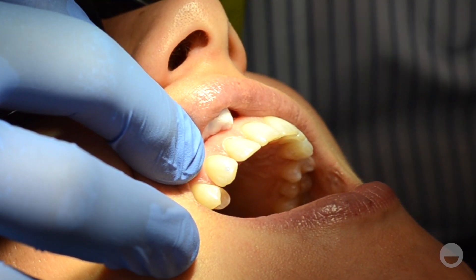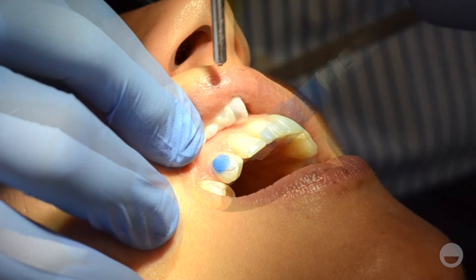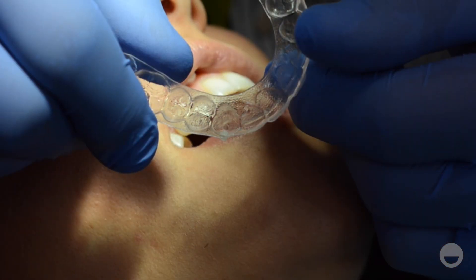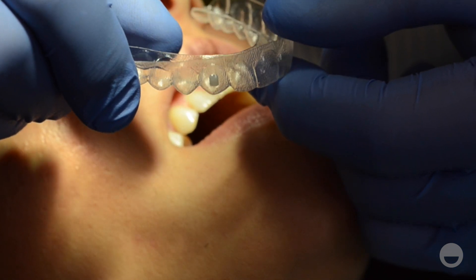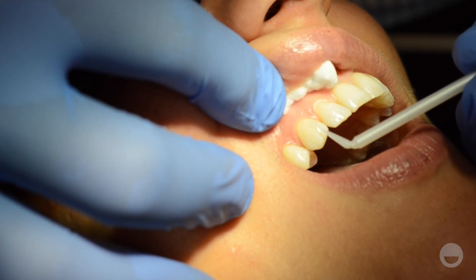Use the acid to etch the tooth wherever engagers will be bonded. Don't etch the entire facial side of the tooth. Thoroughly rinse off the acid. We recommend using low heat to dry the tooth. Fill the engager voids about two-thirds full with the paste type composite first, and then top off the final third with flowable composite. Apply the bonding agent to the etched tooth.